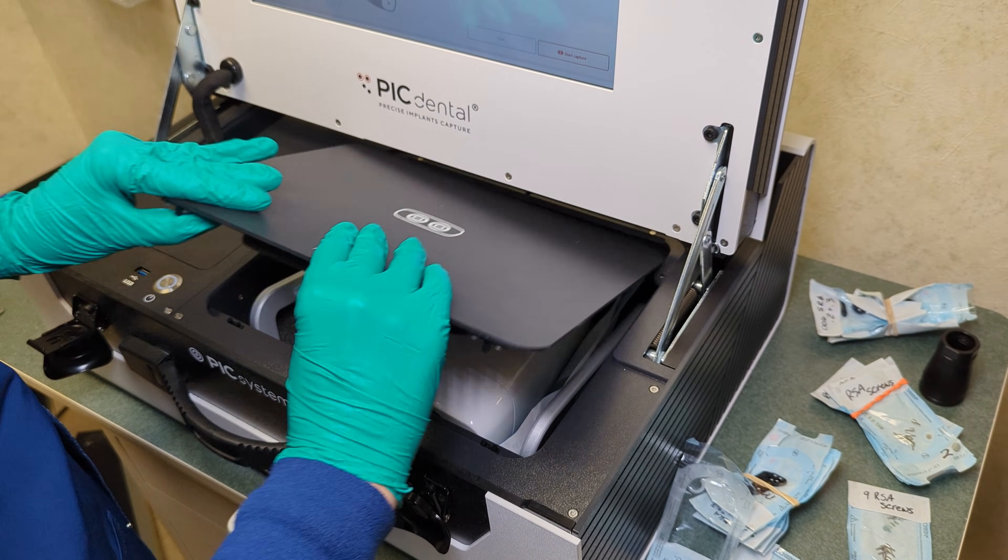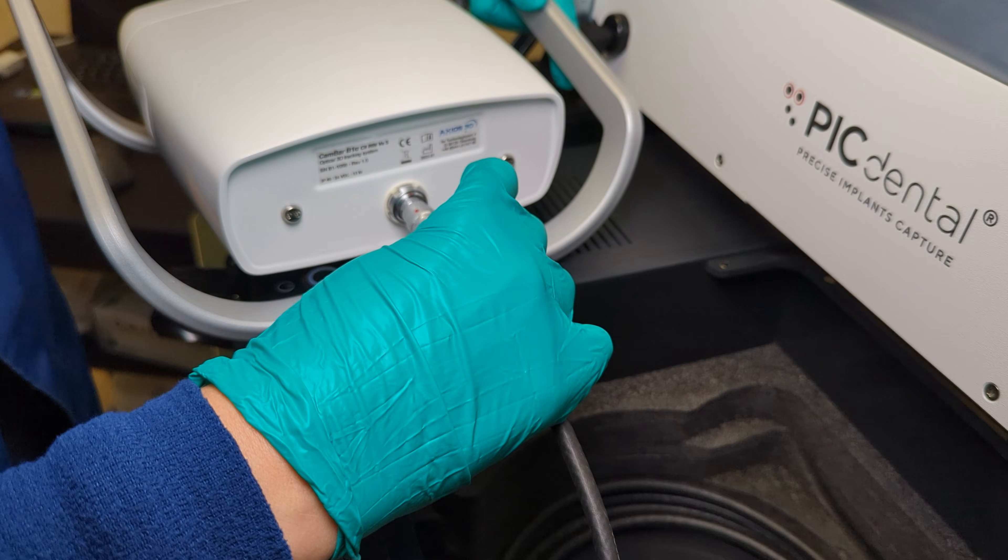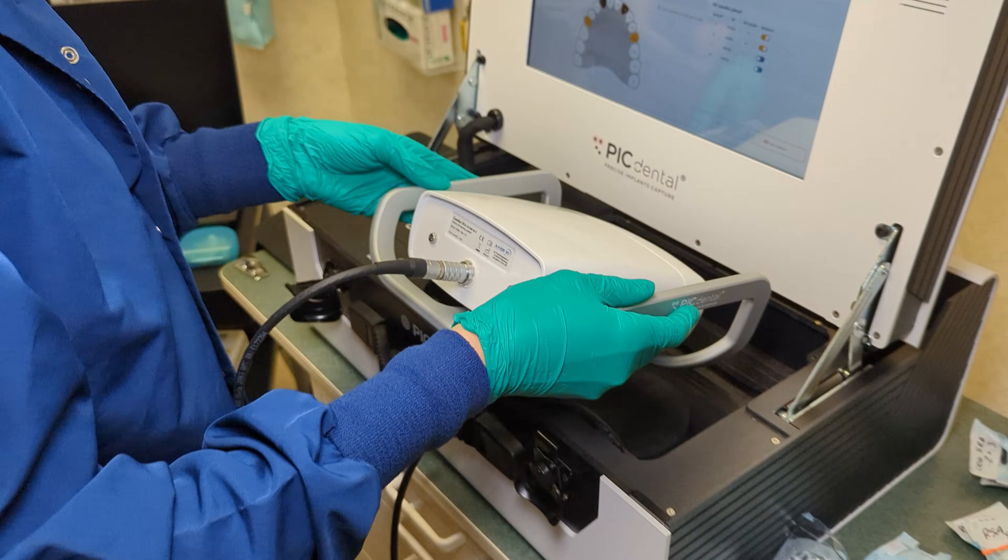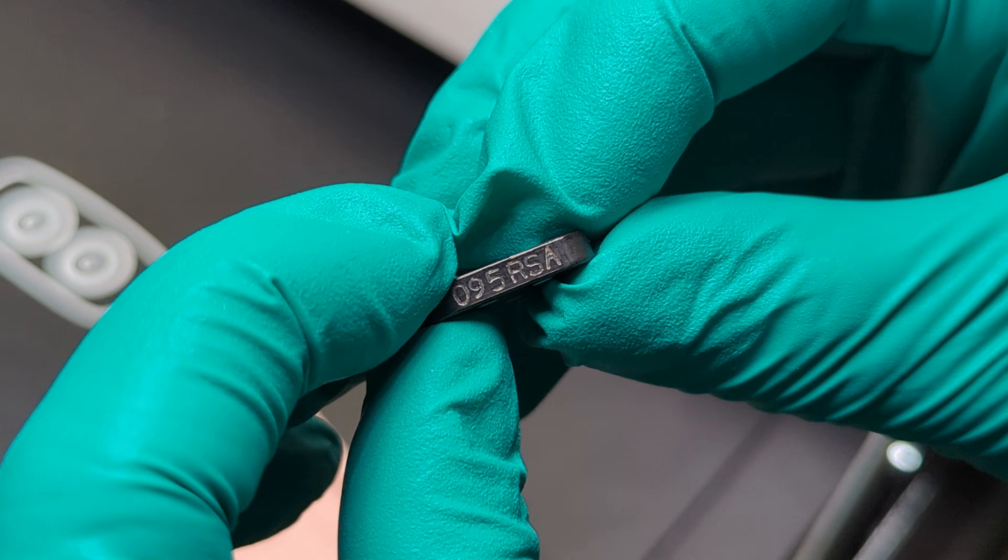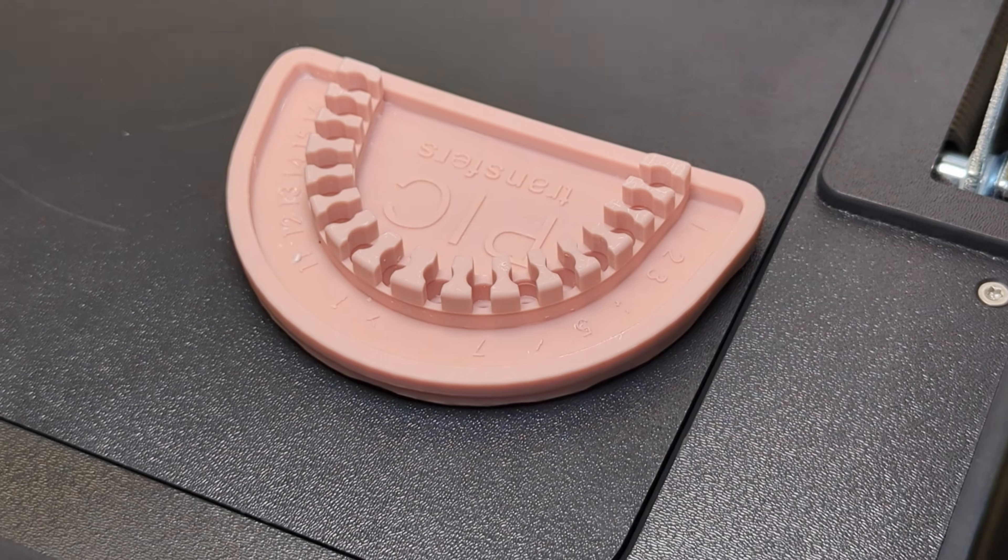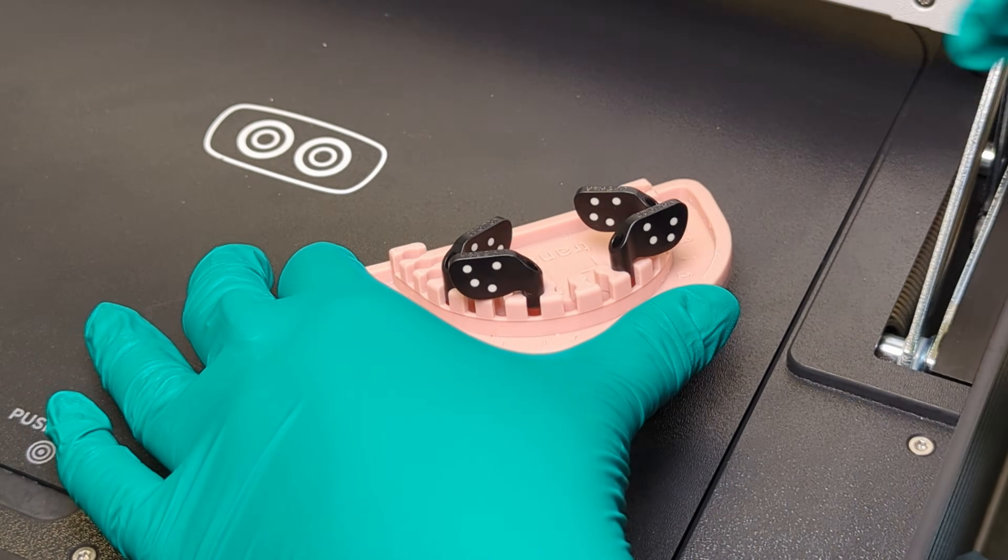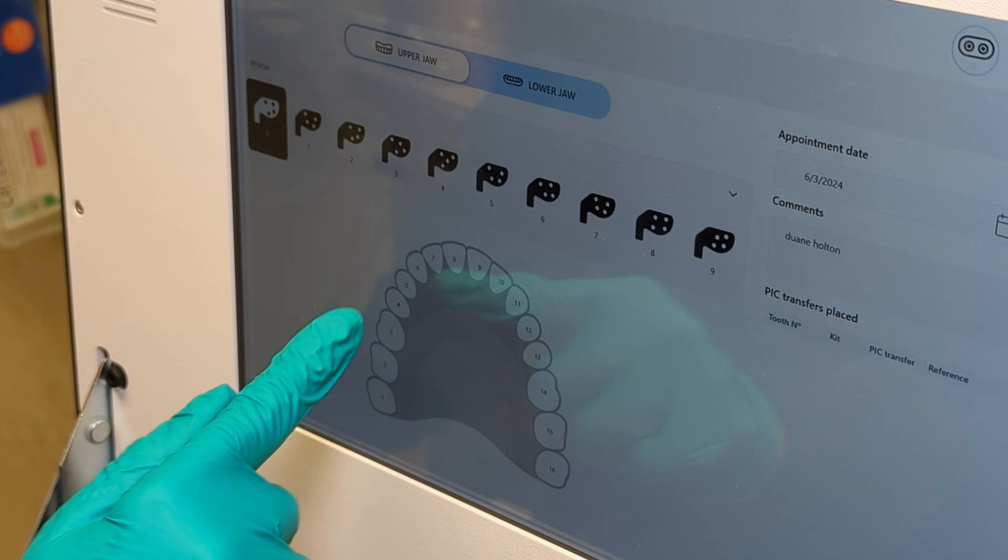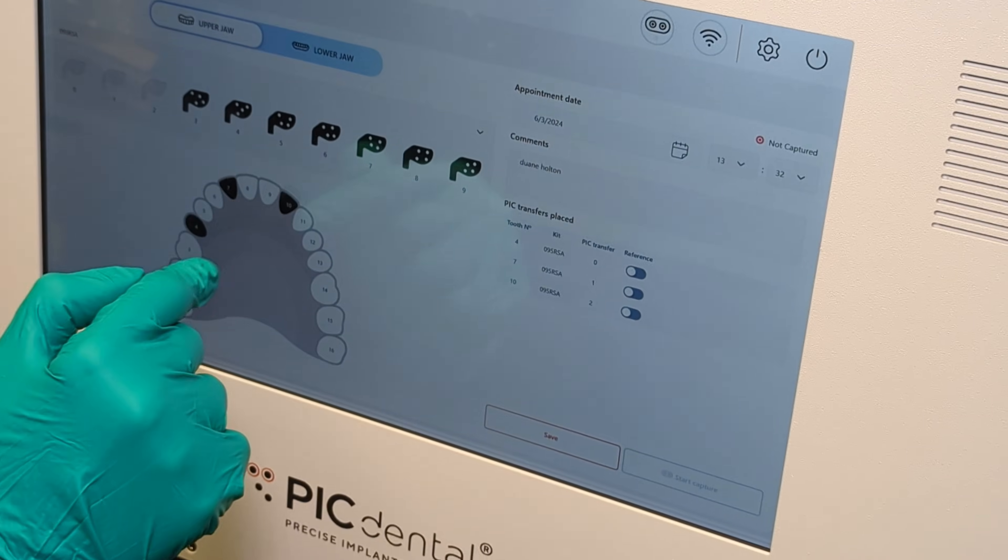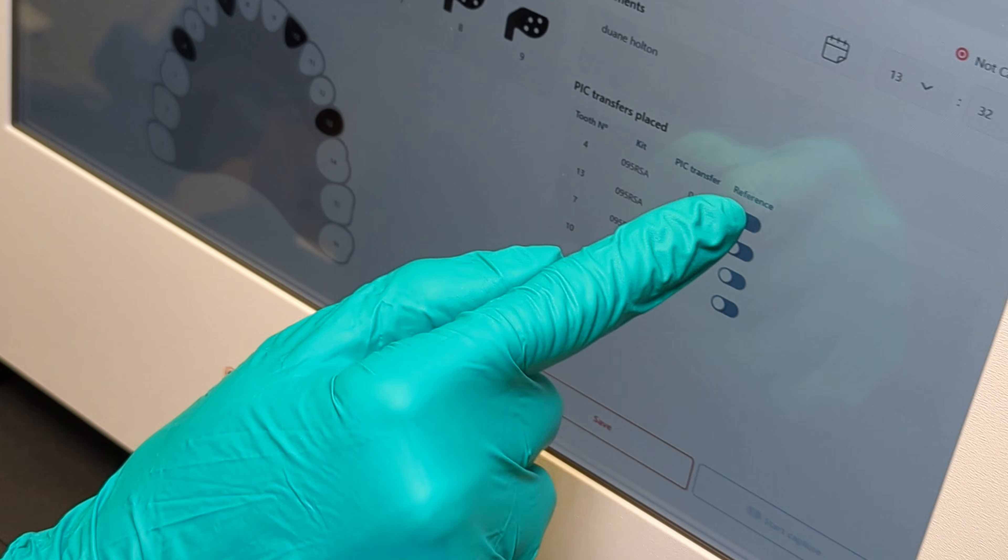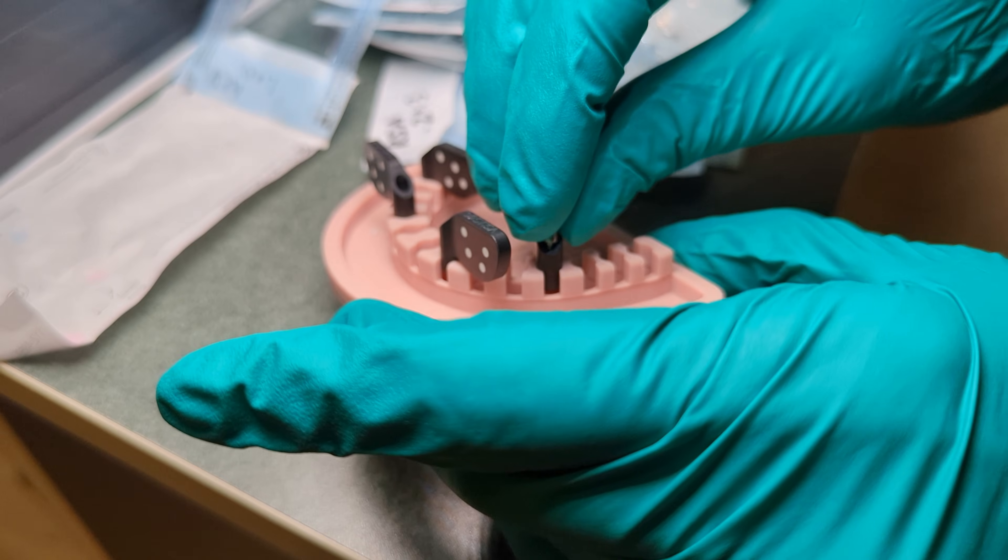Contrary to some information found online, photogrammetry is not a 3D scanner. Instead, it functions more like a camera that captures images of individually calibrated scan flags in the patient's mouth. These images are used to calculate the spatial relationships and distances between multi-unit abutments. However, it does not determine the exact coordinates of these multi-units, but rather their relative positions to each other. Each scan flag is unique and must be assigned to a specific position in the patient's mouth. Therefore, meticulous preparation and organization are essential beforehand.